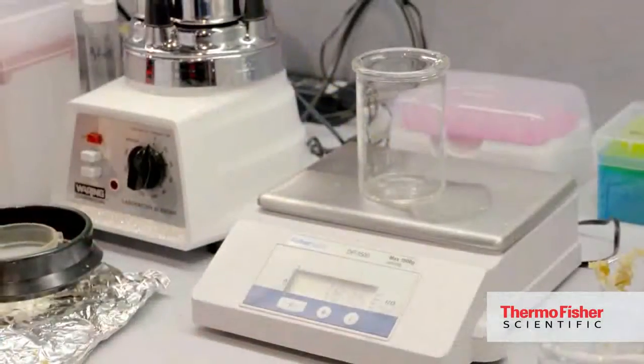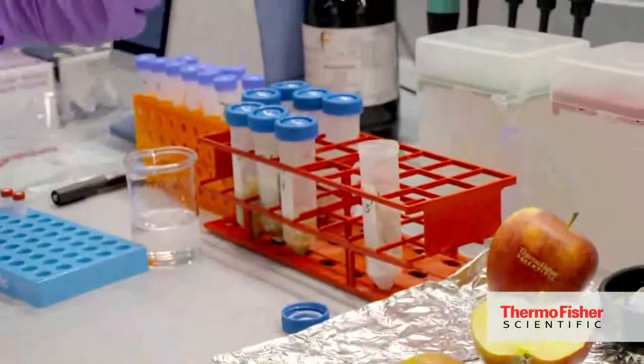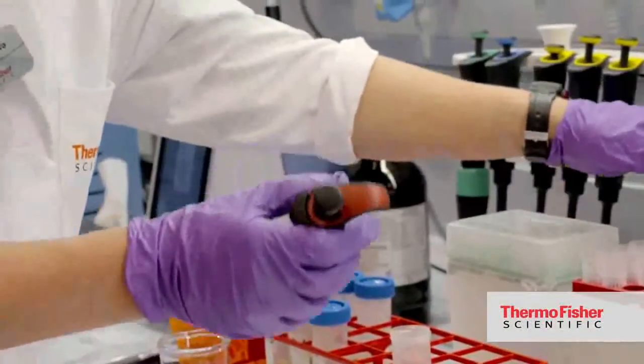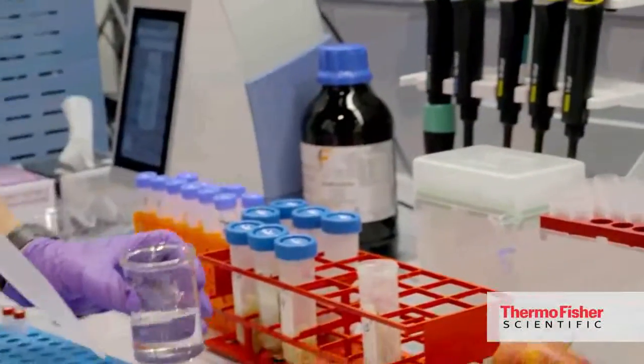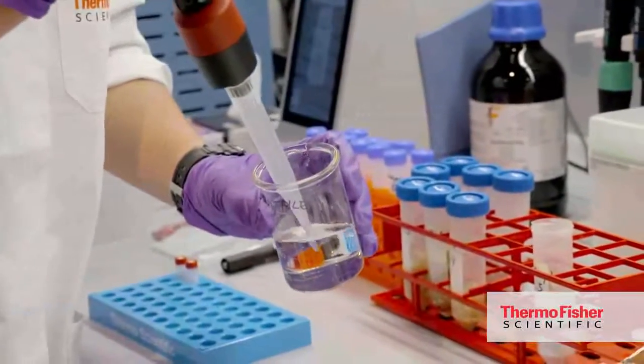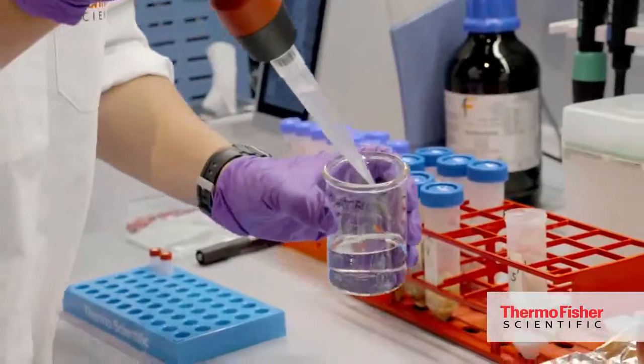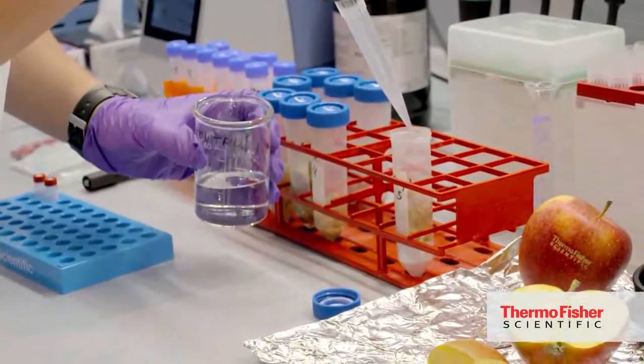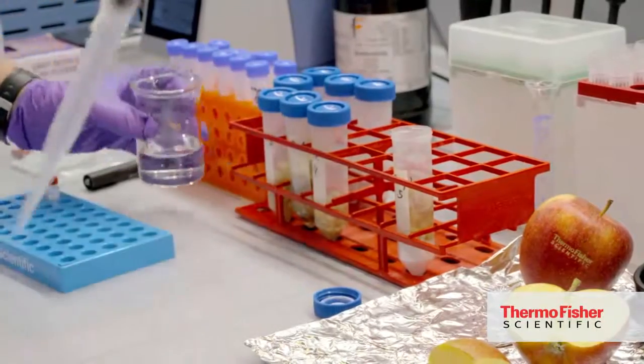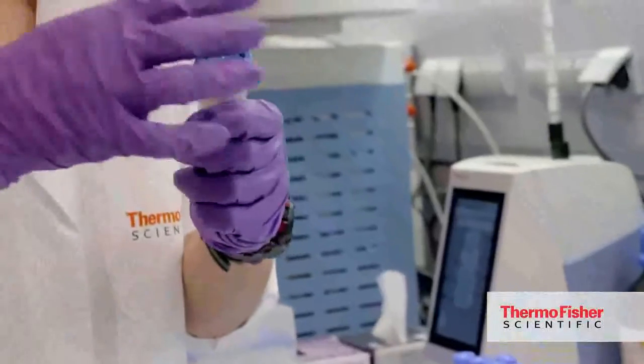So when the sample is weighed, then extraction solvent will be added to it. To 10 grams of sample, we add 10 milliliters of solvent. And the whole tube will be shaken.